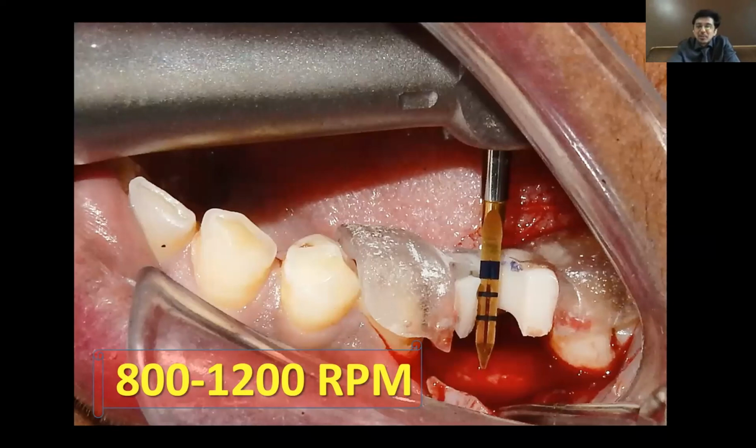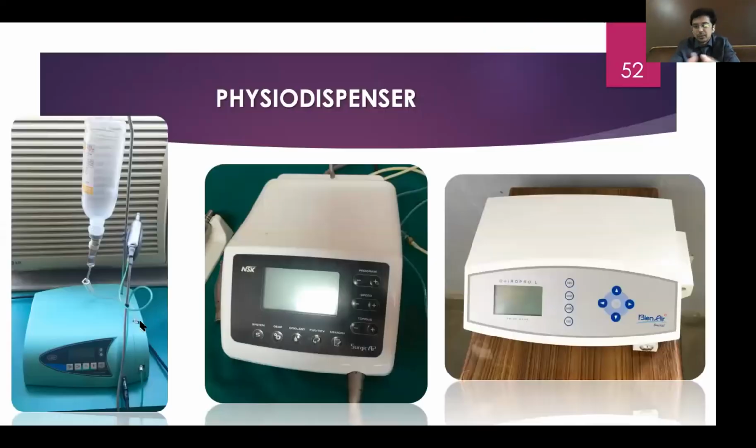So that is the thing which is taken care of in a physio dispenser. You can buy NSK, Surgic AP, which I have been using for the last 10 years, and then the most expensive one, which is not available everywhere, the Bien-Air one, at around 3.5 lakhs.